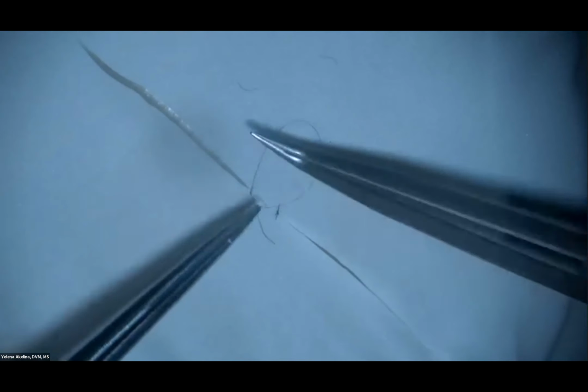This exercise is teaching people to adjust to the pedal and to work with the hand and the eyes together. This is very important because we're only using pedal control for zoom and focus. This is what people need to do when we start doing the live models, so they're familiar with the pedal. And I cut, and we're done. This exercise we do at the beginning of our course.